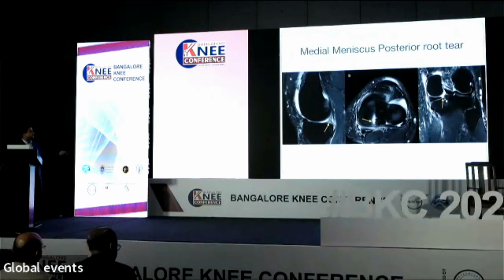So in all the views, the sagittal view, the axial view, and the coronal view, you can identify the root tear. In the sagittal view, you can see the anterior horn. There is an absent posterior horn. We call this the ghost sign.